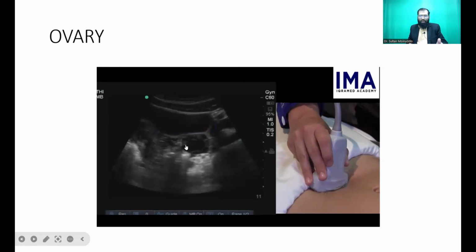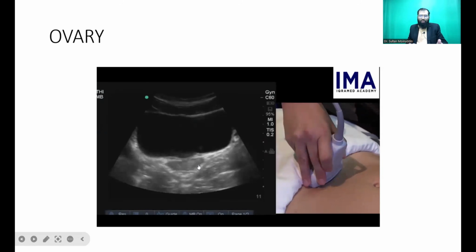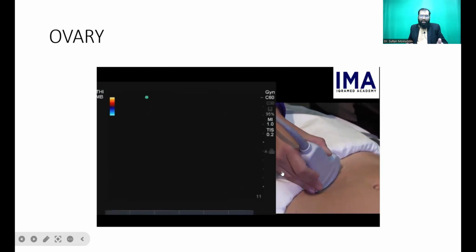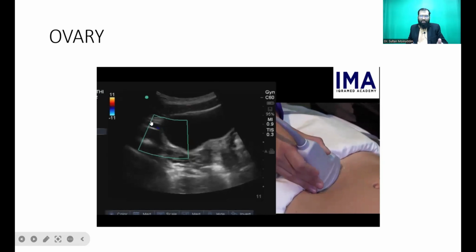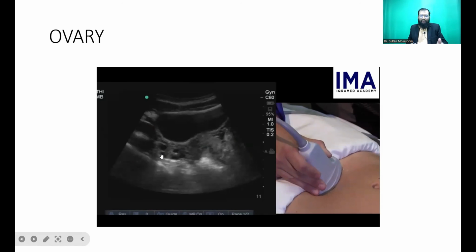Okay. This is the ovary on the left side of the patient, and you are able to see one cyst, so that can be measured. Now this is the uterus. Now similarly, when you want to look at the ovary of the opposite side, again angulate it such that you see the iliac vessels of that side. So yes, these are the iliac vessels of the opposite side. Once you get these iliac vessels, you can see in the color box the external iliac artery, which is showing the flow. You trace it high up, and here comes the ovary. Here you are able to clearly get the ovary.